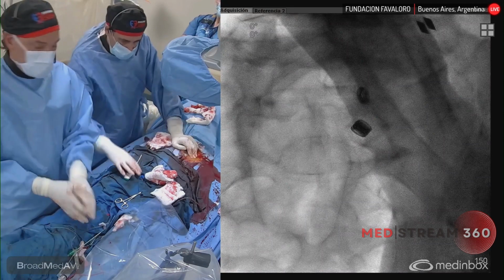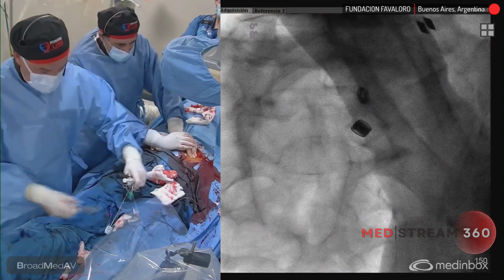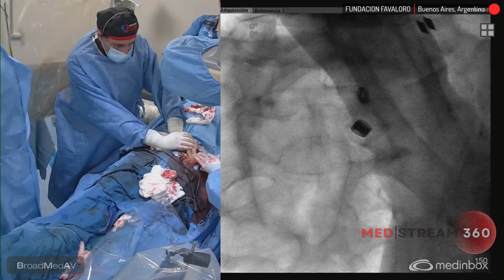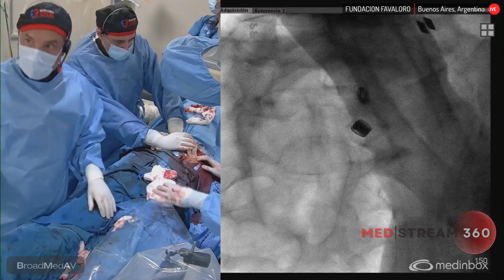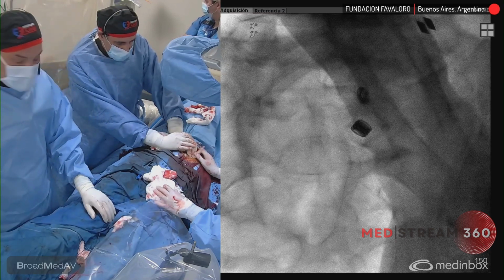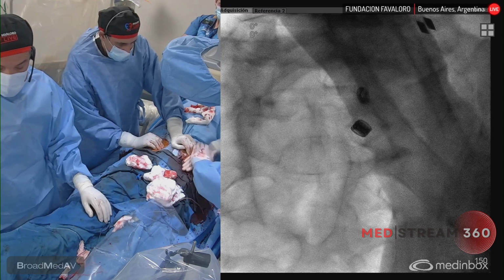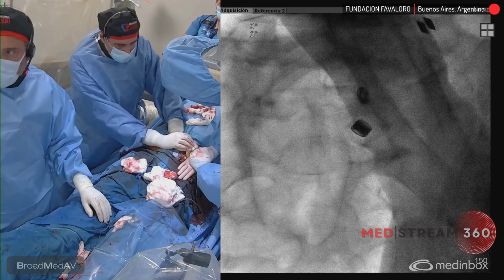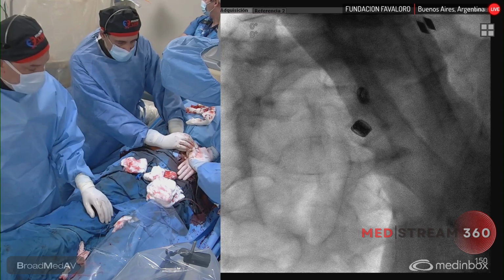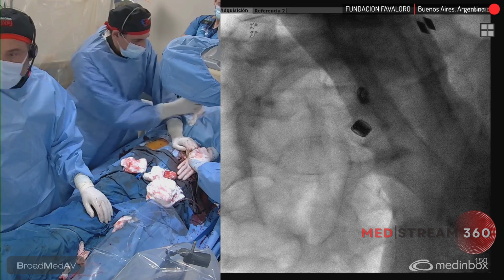So we're exactly on time. We really passed a very tough situation, but fortunately we reached a very nice outcome, not only on the right coronary ostium, but also on the TAVI case, in this case for this valve-in-valve with the previous cracking. The patient collapses after the cracking, but there was no mechanical complication and everything is okay.